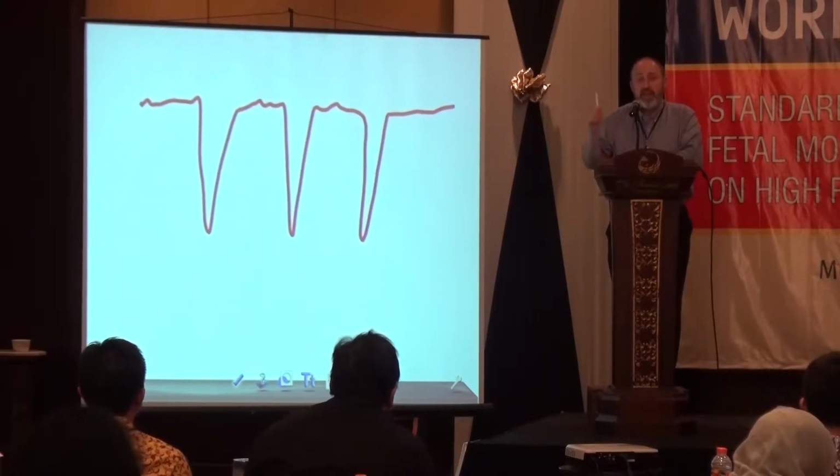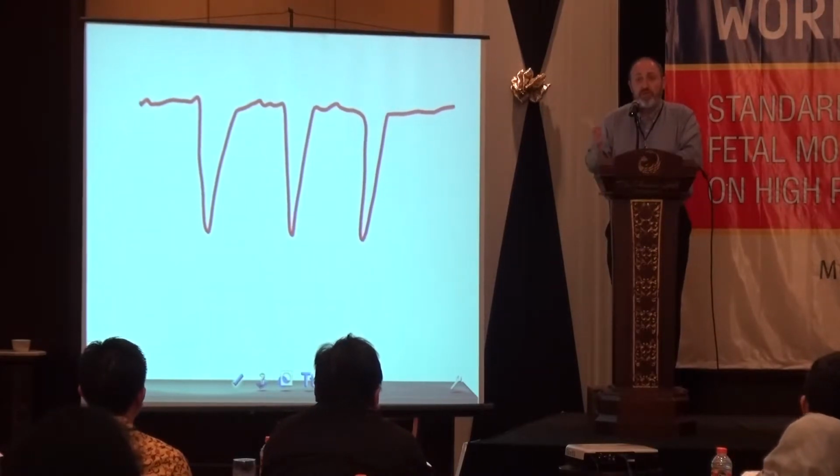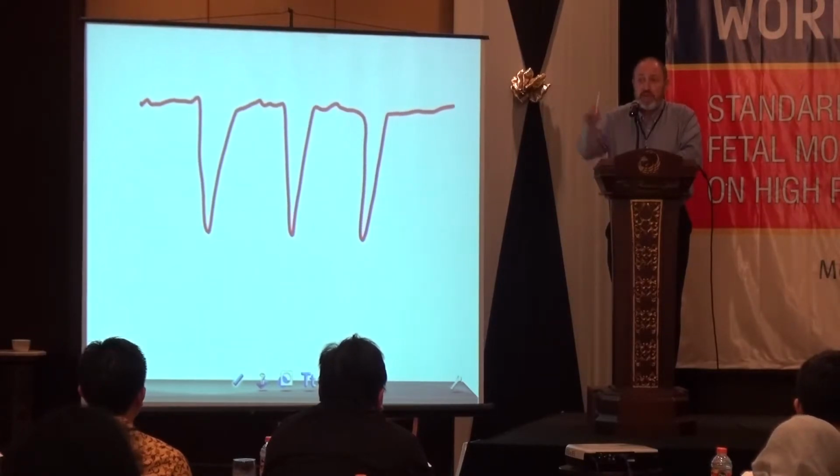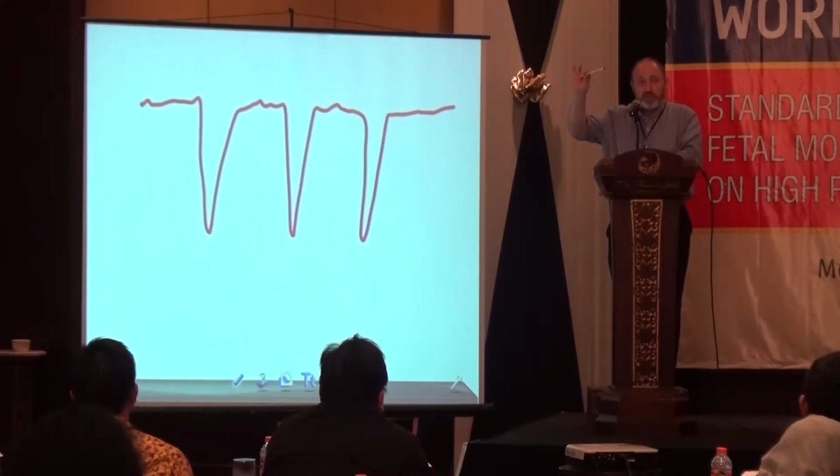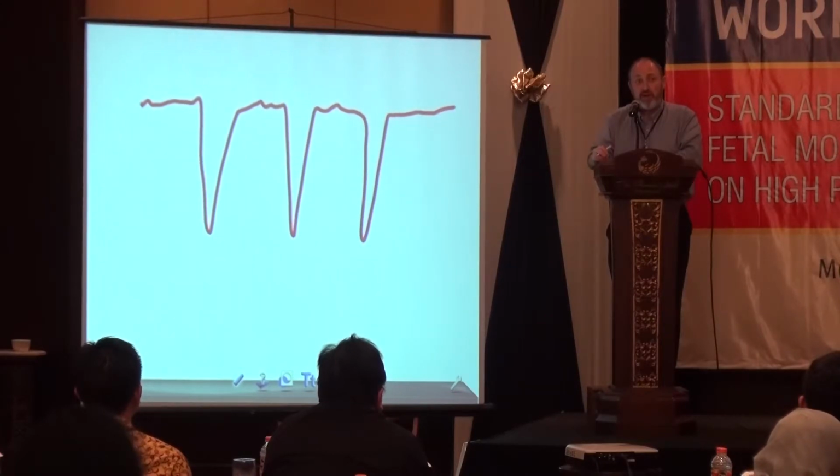It does not mean that every baby that has got an absence of shoulders will be compromised, but it does mean that those infants are at greater risk, increased risk of being compromised with overshoot and recovery, and even more increased risk with the absence of shoulders entirely. Does that make sense?